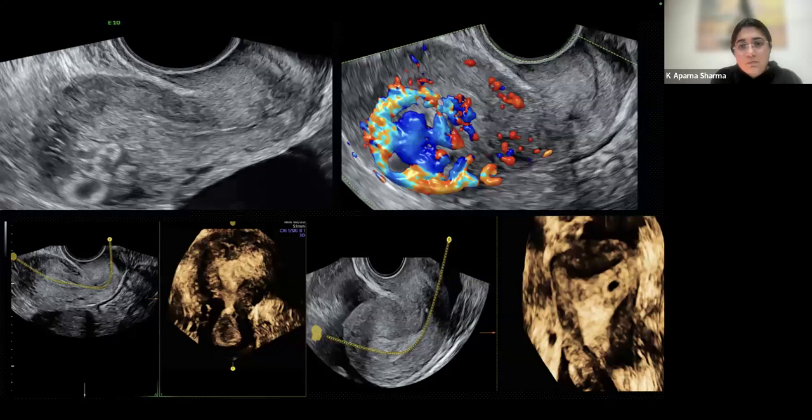We need to inform the obstetrician, especially if it is bulging outside and the myometrium is deficient on the outside part. There is a high chance of rupture, and these are very vascular areas. Just like in tubal rupture, the patient might be stable, but in cornual ruptures, these interstitial ones, the patient will directly go into shock.